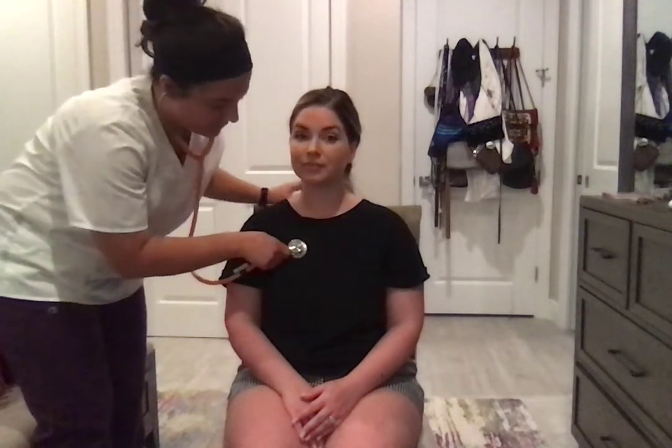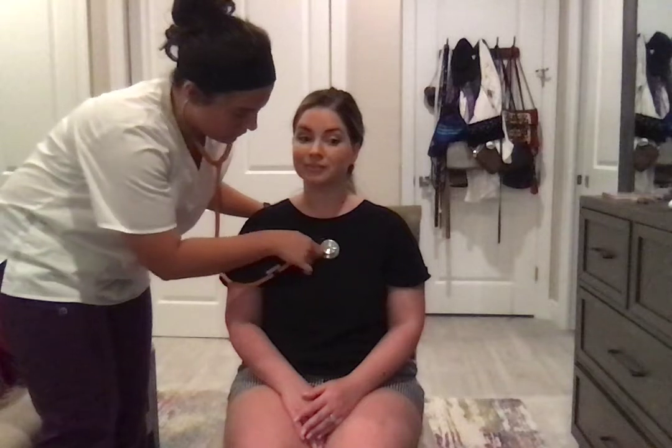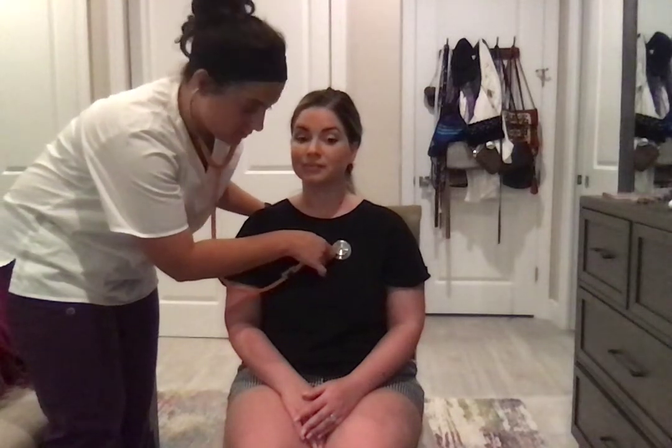Okay, awesome. So now I'm going to auscultate to the 5 points of the heart. So first, with both sides of the stethoscope. Okay, so first, I would go second intercostal down, and just go directly across.